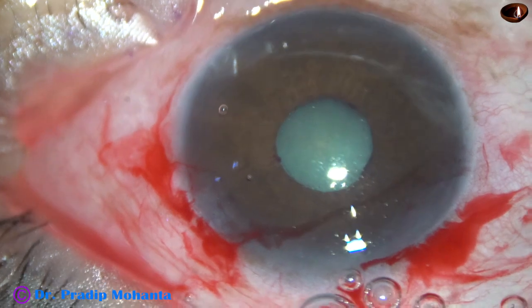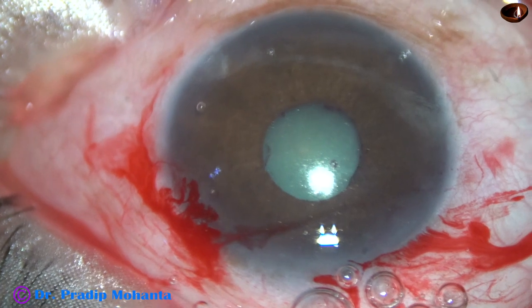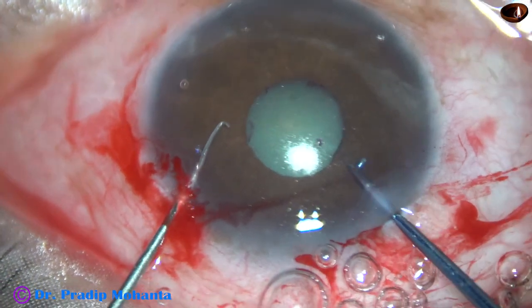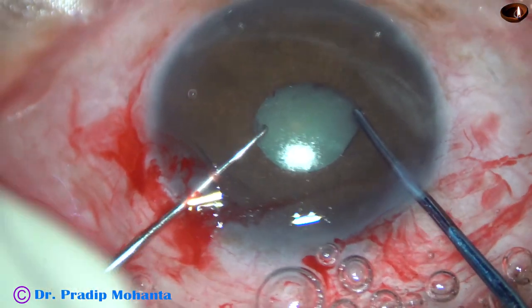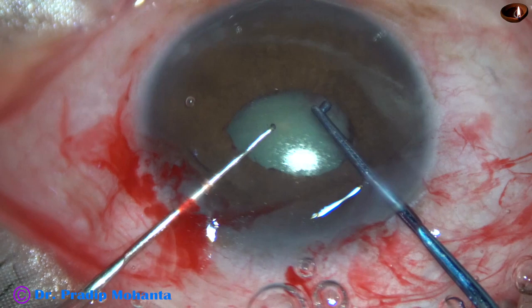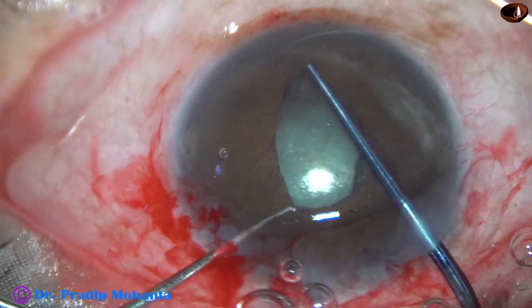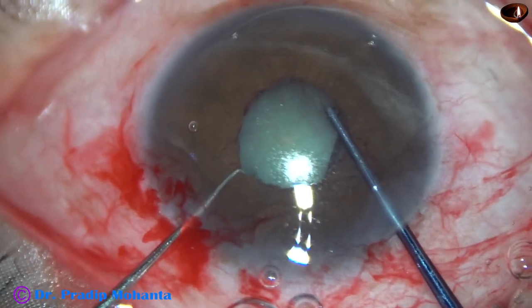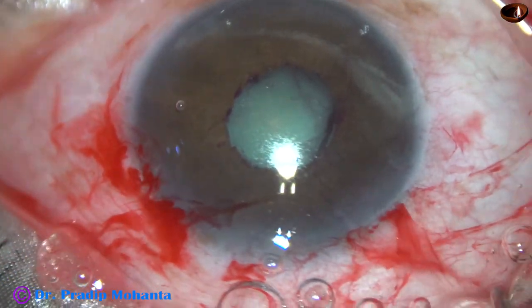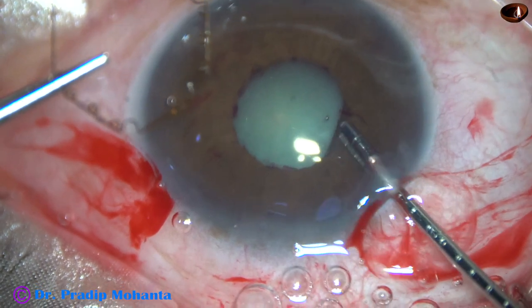Now the pupil is very small, about 2.5 to 3 mm. When the pupil is so small, before applying any pupil expansion ring like B-hex, we must dilate the pupil by stretching to about 4 mm. I have a Kuglen hook in my right hand and a Sinskey hook in my left hand. It is better if you have two Kuglen hooks, but I had only one Kuglen hook in my surgical armamentarium. And now the size of the pupil will be about 4 mm.